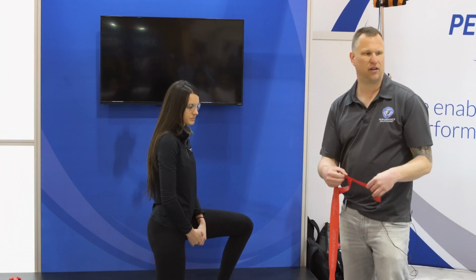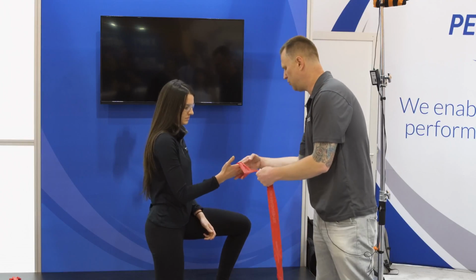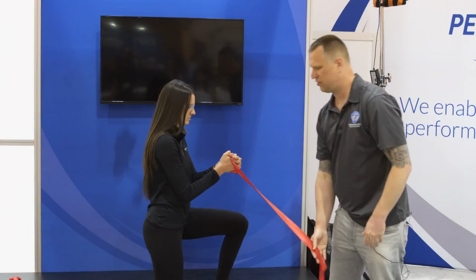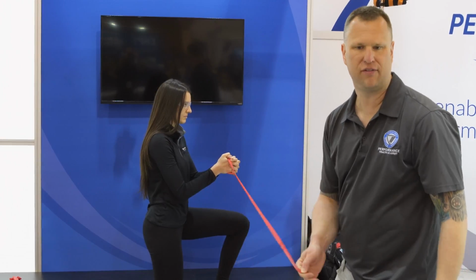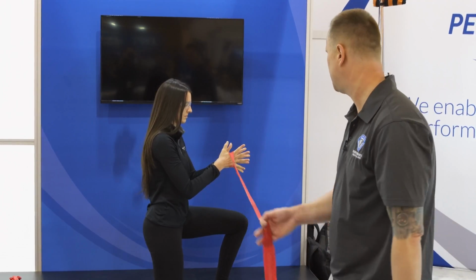But if we take the CLX in that position, and I'm just going to loop that into her hand, and she's going to interlock her hands together around that loop. Now all of a sudden I'm here as a clinician, I can be in here pulling. Now yes, again, a flat band could work for this. The advantage of the CLX is, again, she's gripping on that loop, she's having to stabilize.